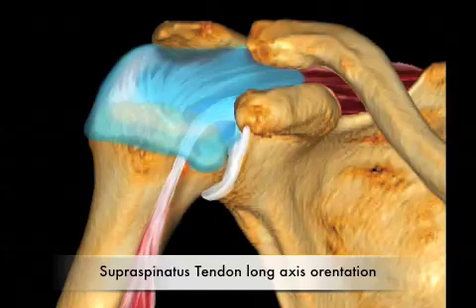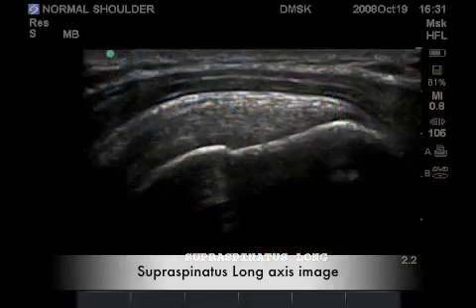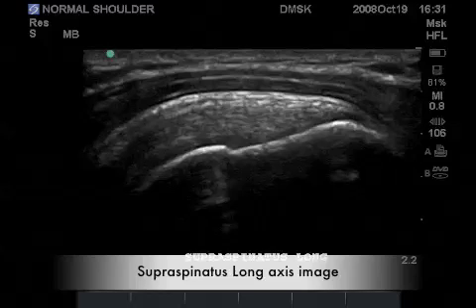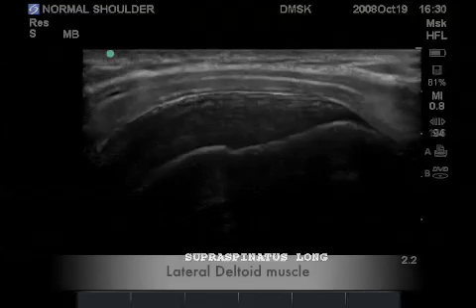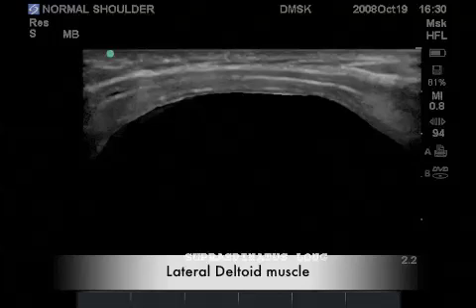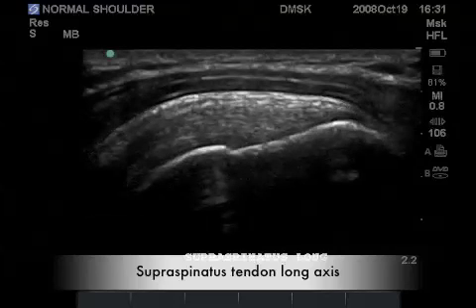We now turn the probe from a transverse slice of the tendon to a longitudinal slice of the tendon, which is similar or comparative to a coronal slice on an MRI. Here is the representative long axis image of the supraspinatus tendon, with the humeral head and greater tuberosity in profile similar to a lateral radiograph or coronal MRI. Here we have the lateral deltoid muscle, also in long axis, and the true supraspinatus tendon at its lateral to anterior margin of the greater tuberosity.